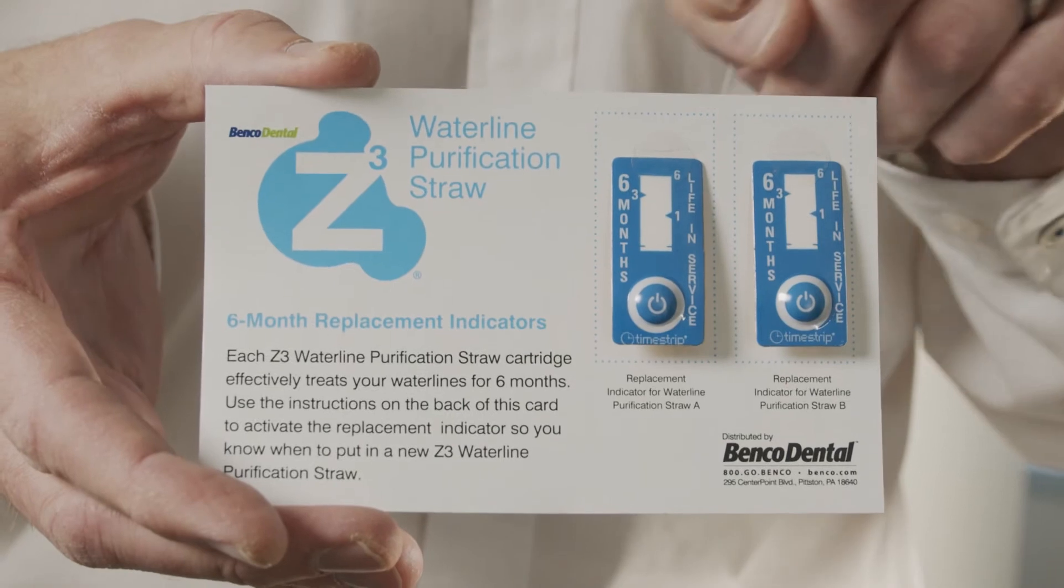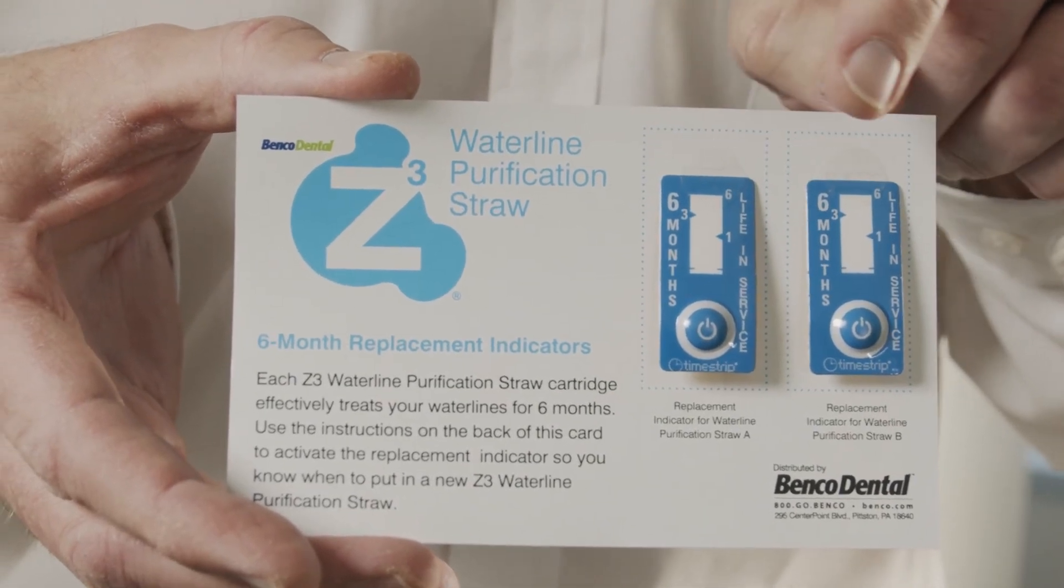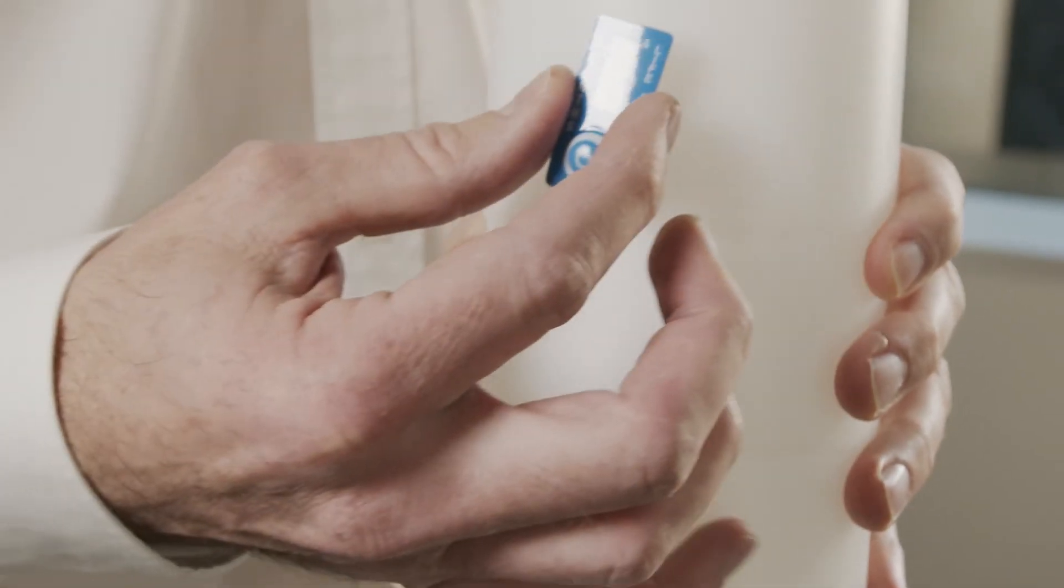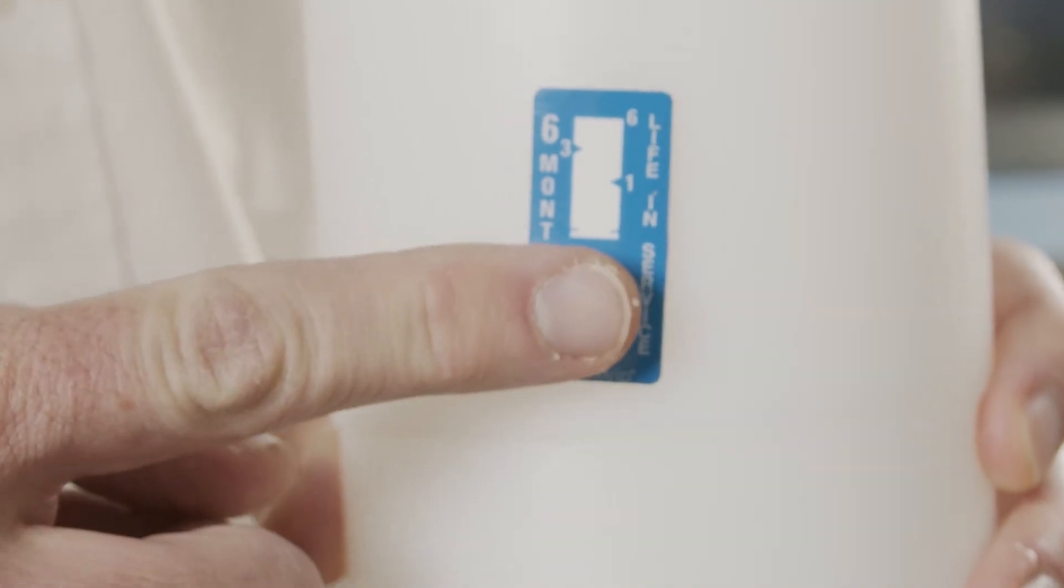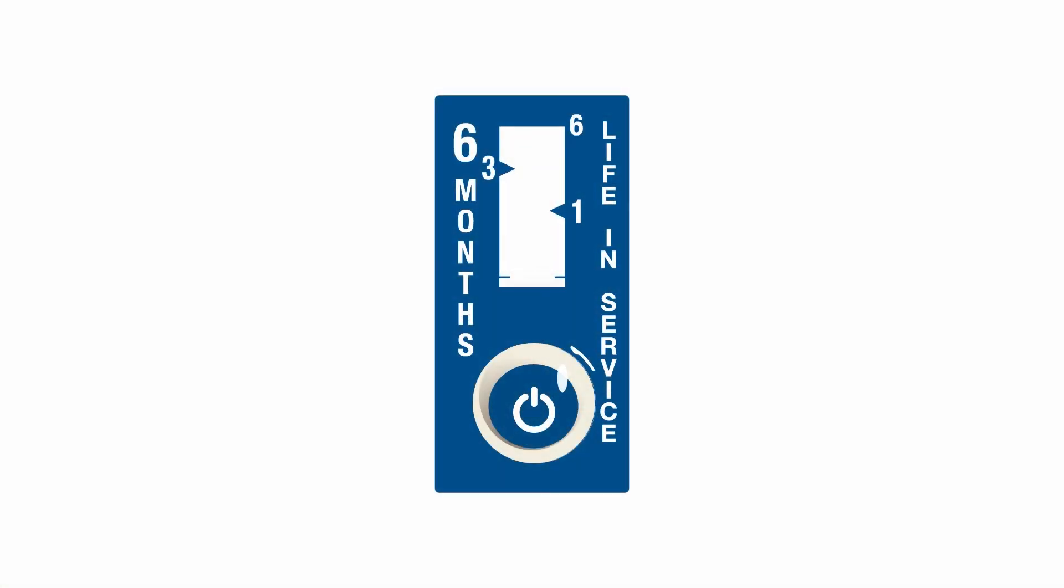And just to make your life even easier, the Z3 straw comes with an automatic replacement indicator. Just press the indicator, wait until the bottom line fills with red, and let the indicator do the rest.